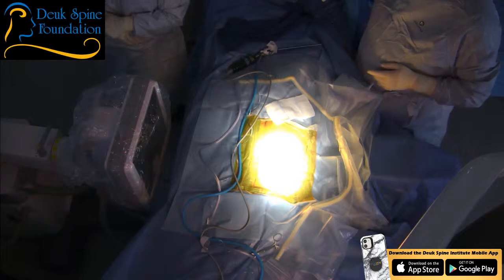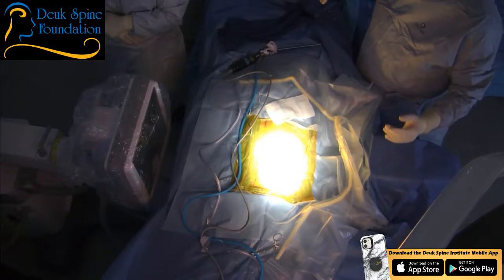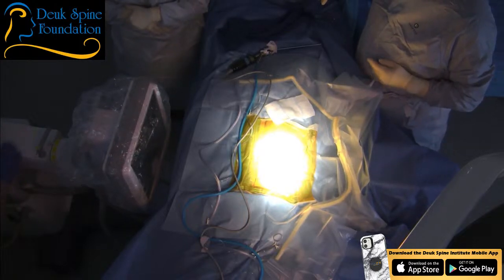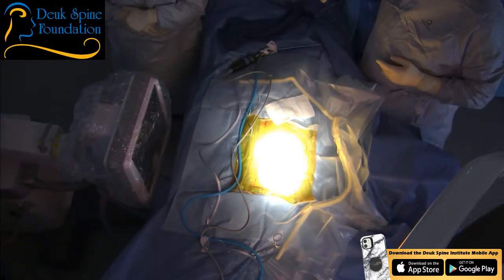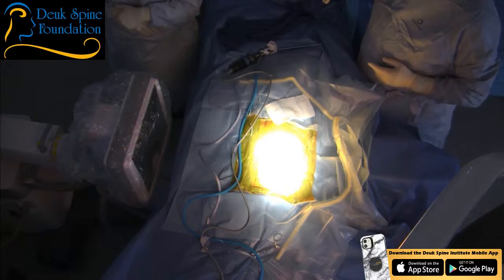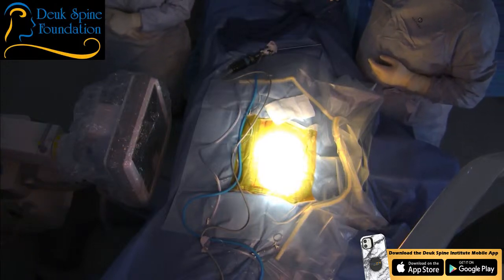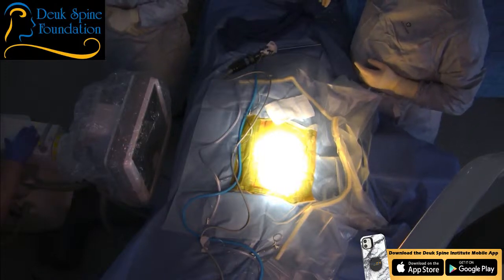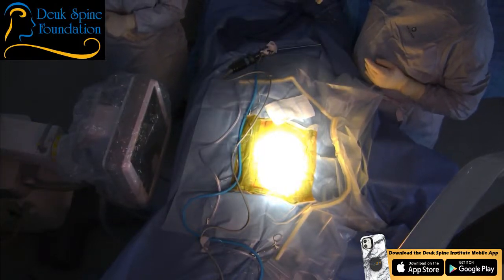That's better. I think you're going to need to wag this side a little further north and bring your base further south. So folks, what we're doing right now is we're trying to position the fluoro machine so that I can navigate safely to where I need to be. We're not far off, guys. We're pretty close, but there's still a double shadow on the top of the pedicle of L5 that we need to fix.